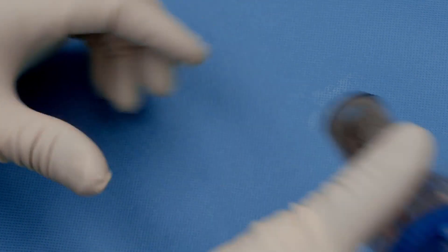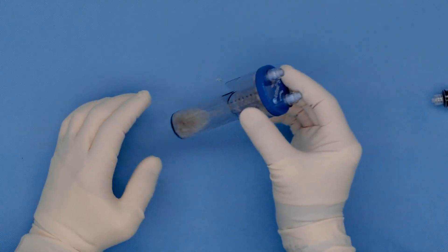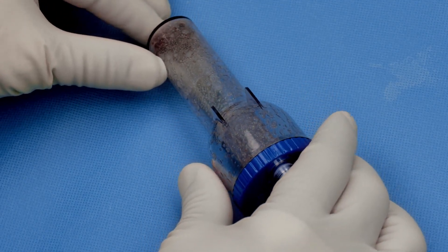After injection of the 4 ml of ACP, you shake the thrombinator for 5 seconds and then put it back flat on the table with the injection site down.